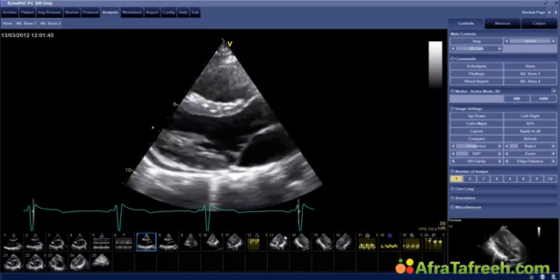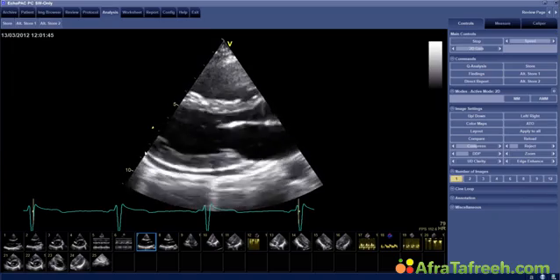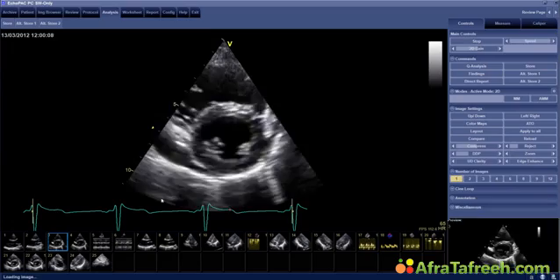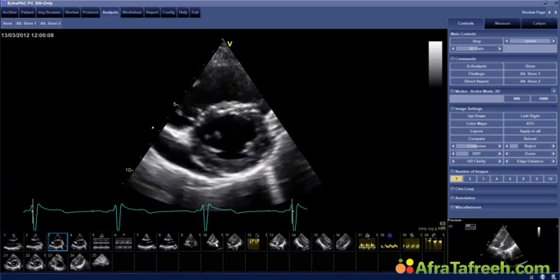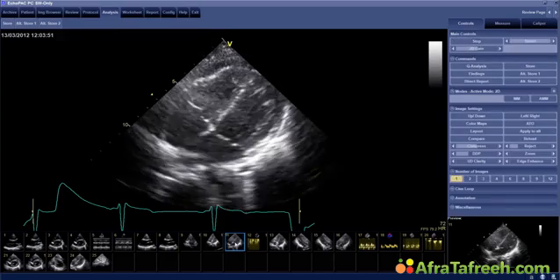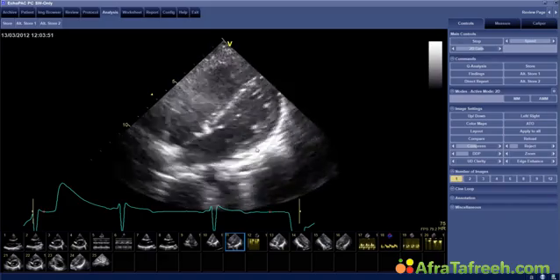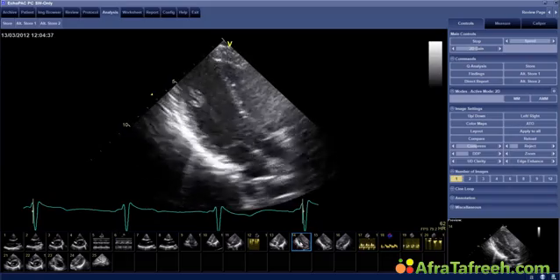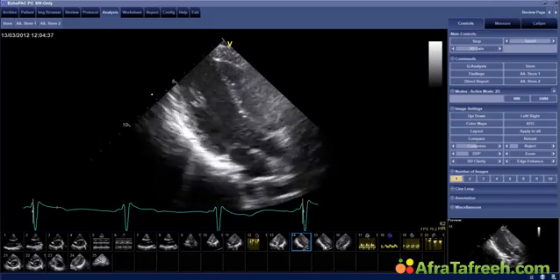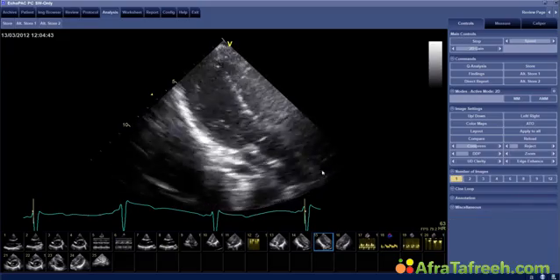Parasternal long axis view. I'm sure all of you also see that there's another feature on this echo which should not be there, namely this pericardial effusion. You can also see this here. This is pericardial effusion. Now the patient was very slim and difficult to image from the apical views. Those are the images I got, but I think you can quite nicely appreciate the left ventricle here and the function. Okay, this is the apical long axis view.